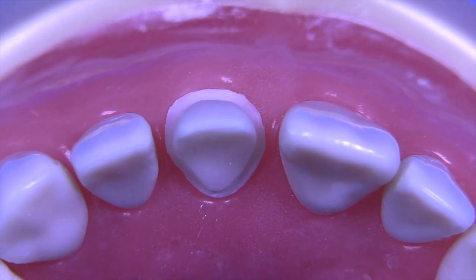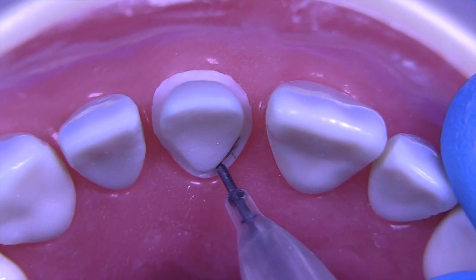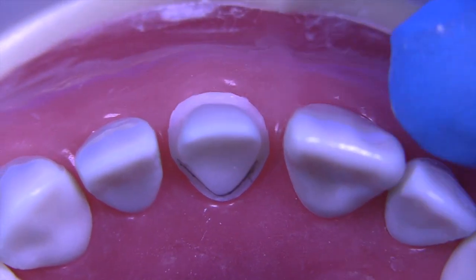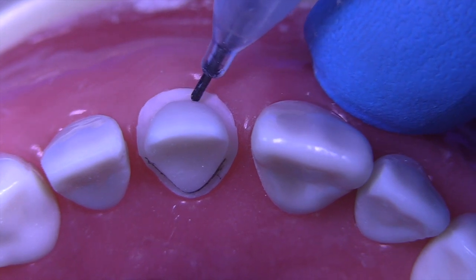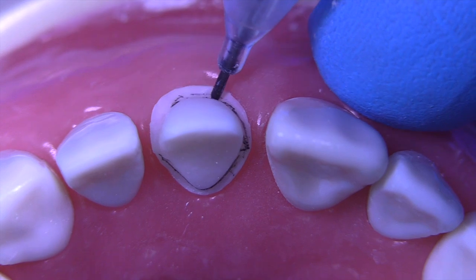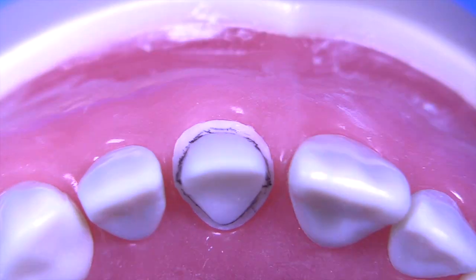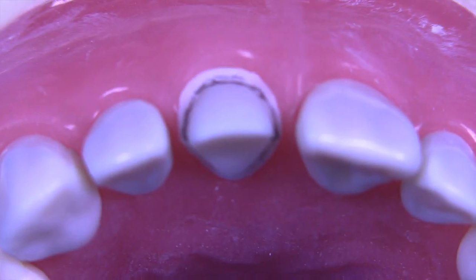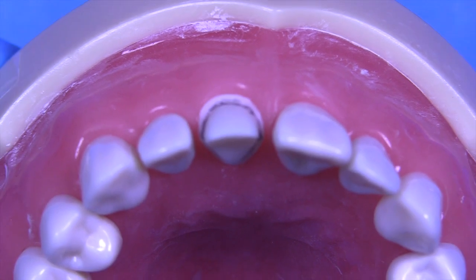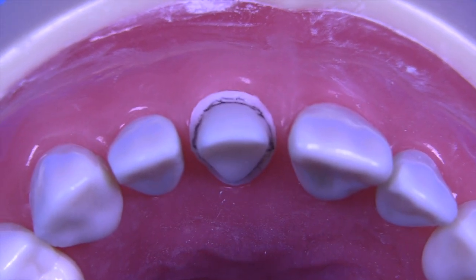And one of the most important things you can do, and you can actually do this in most examinations, you can mark the internal between the margin or the finish line, right, and the axial wall. You can come around this way and you can mark it 360 degrees. You can do this in the mouth. So you can see here on the facial, let me back up a little bit so I stay in focus. There, right there. Okay, there we go.